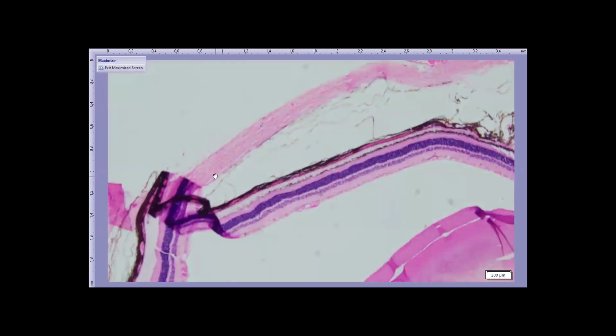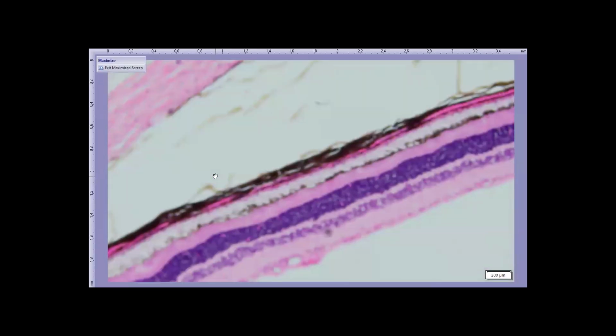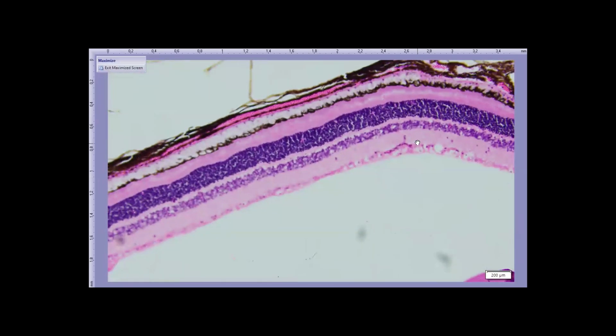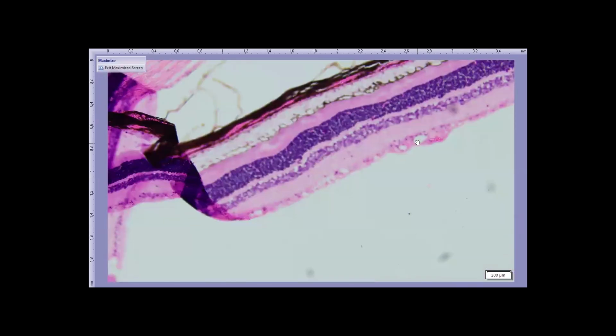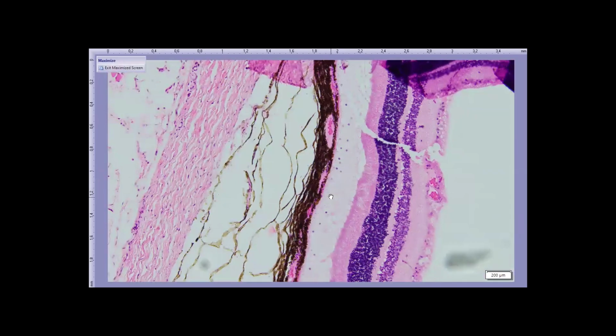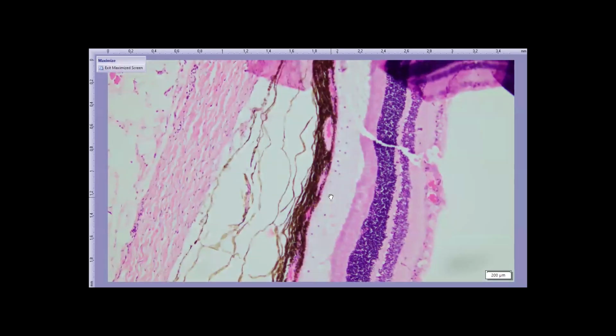And if we go on this side, you can see that the retinal pigment epithelium has pigment, and I think if we go even further, it becomes more cuboidal. And if we keep going in this direction, the pigment will disappear, and the cytoplasm of the cells will be very thick and kind of foamy appearance. And histologically, ultrastructurally, that's a whole bunch of little oil droplets.